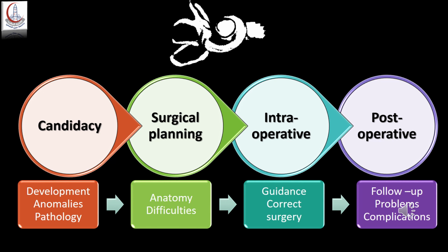Radiologic study is essential in determining the candidacy of the patient, the normal anatomy, and the abnormalities which we can face, so as to properly plan our surgery. And this is the second role of radiology, to make a surgical plan beforehand so as not to be surprised by any unpleasant surprises.